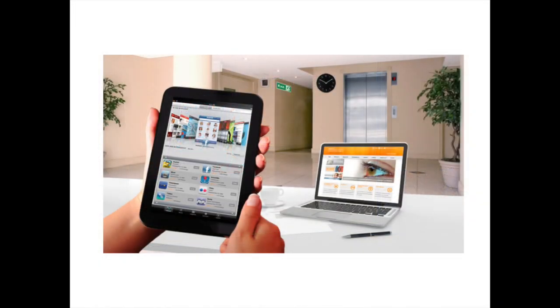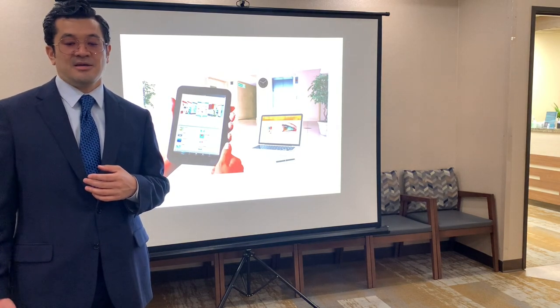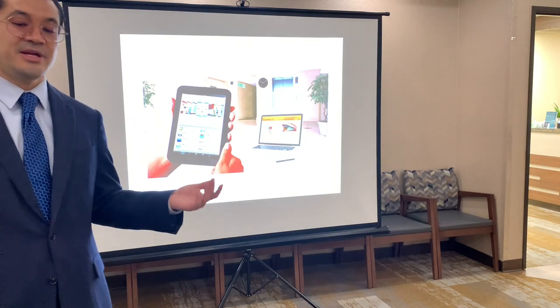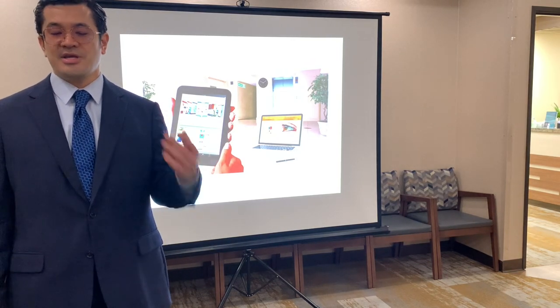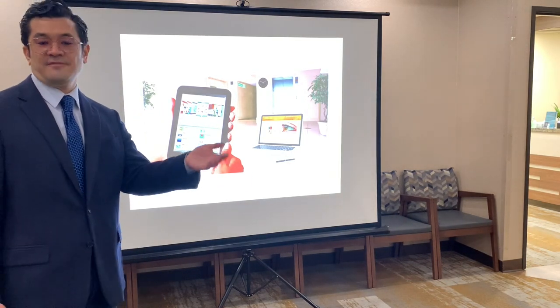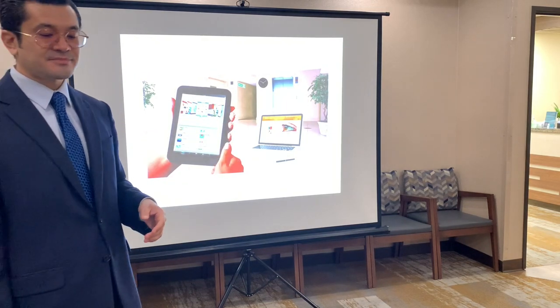So if someone's sitting at a table, they want to look at their phone, they want to look at their computer, and they also want to see down the hall on the clock on the wall. So this is a really nice picture to kind of explain these three main zones of focus, right? Because you've got your reading, your computer, and your phone. So you can describe it to the patient. Imagine you're sitting at your desk at home. What are the objects around you? What are the distances? You've got your computer, you've got your watch, you've got your clock on the wall.